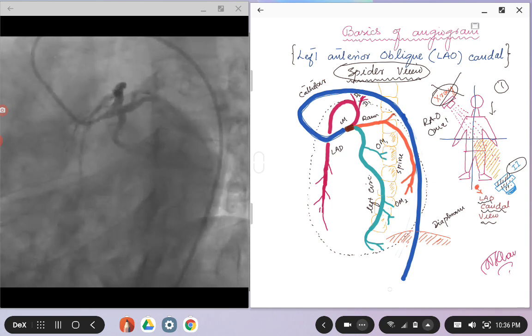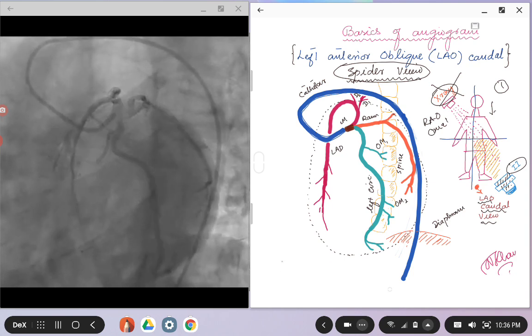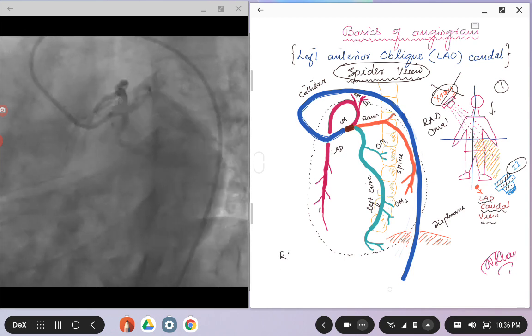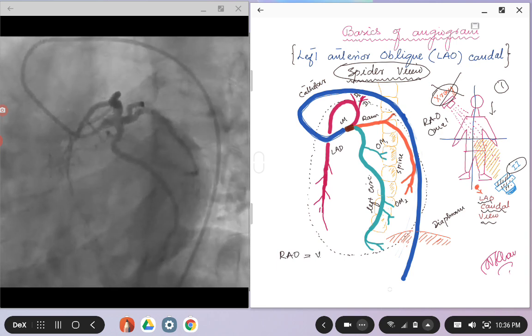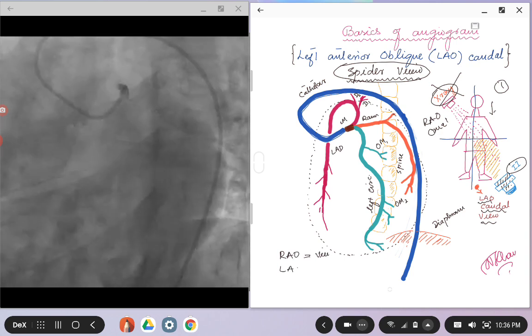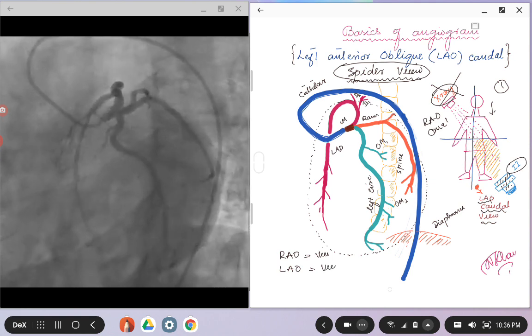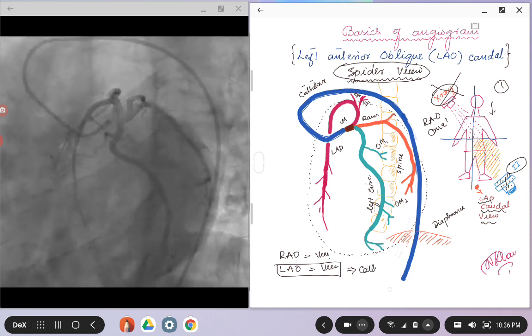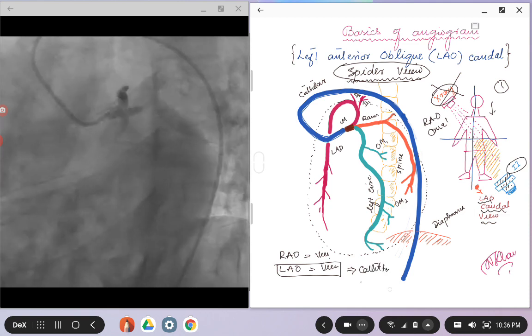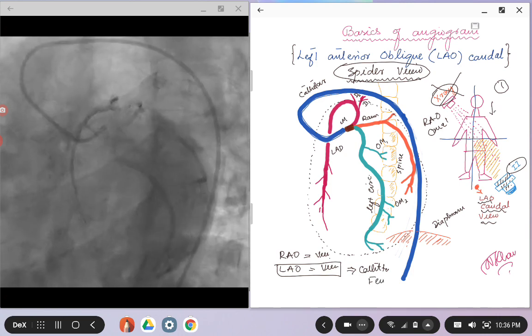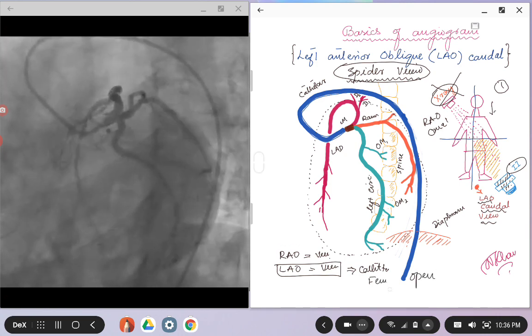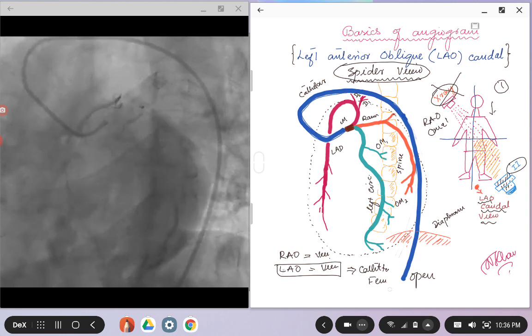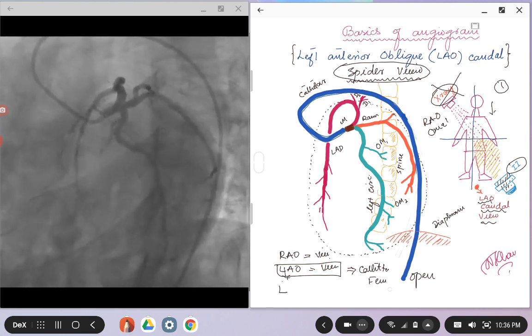One thing you all have to know is, as we talked about, there are RAO views and LAO views. In LAO views, your catheter, if the patient is getting angiogram through the femoral axis, the catheter will be open. The way I remember that is if you take the L of this LAO view, L is open.